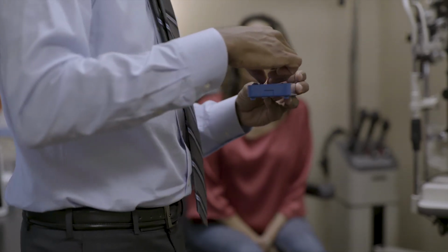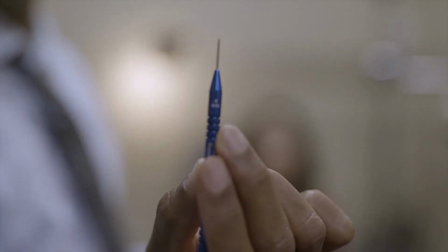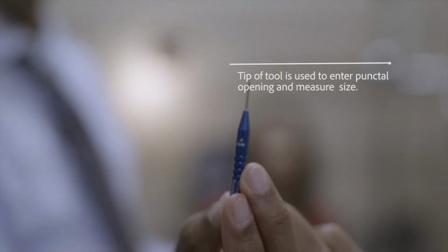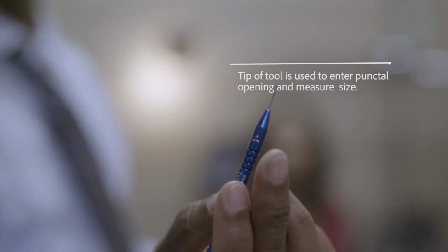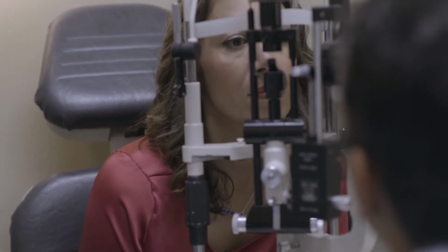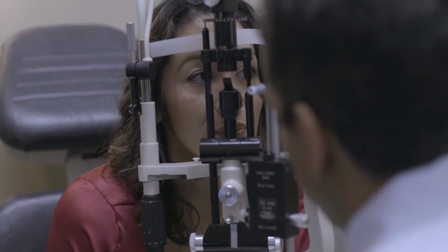So you want to take a look. We're going to measure how large her puncta is. You can see there's a number on here, and there's a little opening. That 0.4 means it's a 0.4 millimeter diameter puncta. And then on the other side is a 0.5. And you want to measure both sides. Are you comfortable like that? That's fine. You want to raise it? You're good? It's okay.